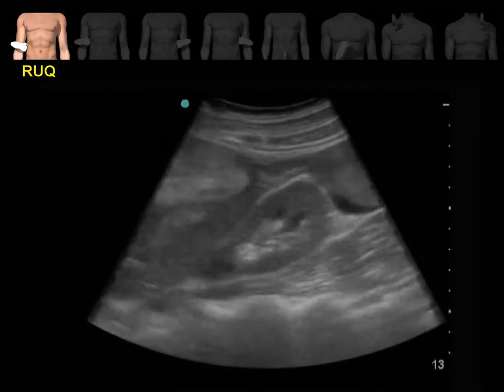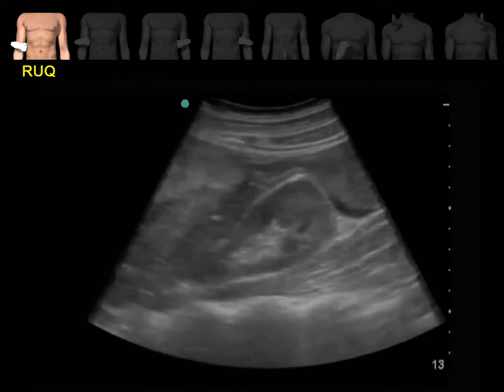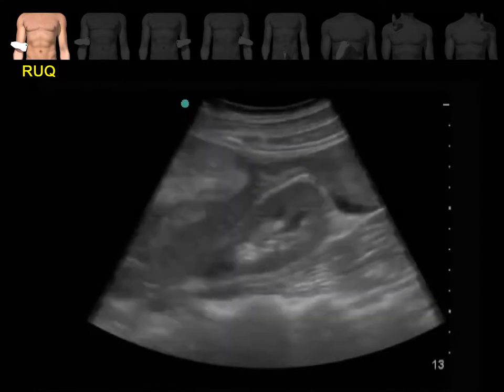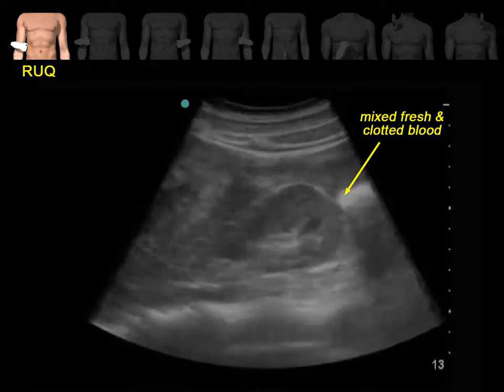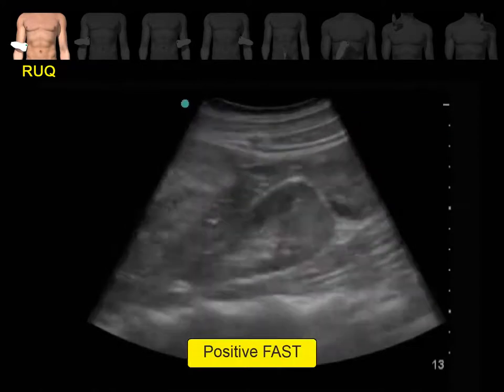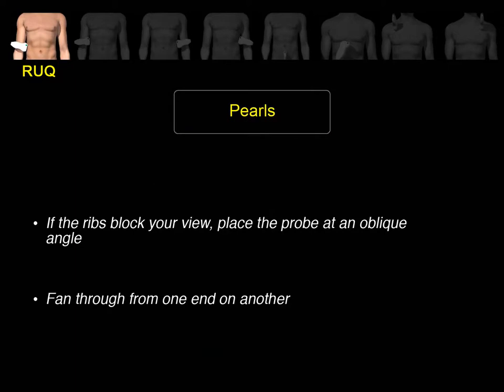This is an elderly female who presented to the emergency department two days after a fall. We can see a mixture of fresh and clotted blood at the inferior tip of the right kidney — a positive FAST exam in the right upper quadrant. If the ribs block your view, rotate the probe slightly clockwise, keeping the probe marker towards the posterior axillary line, so the probe will fit between the intercostal space. Always fan through from one end to another to make sure you scan the whole anatomical space.